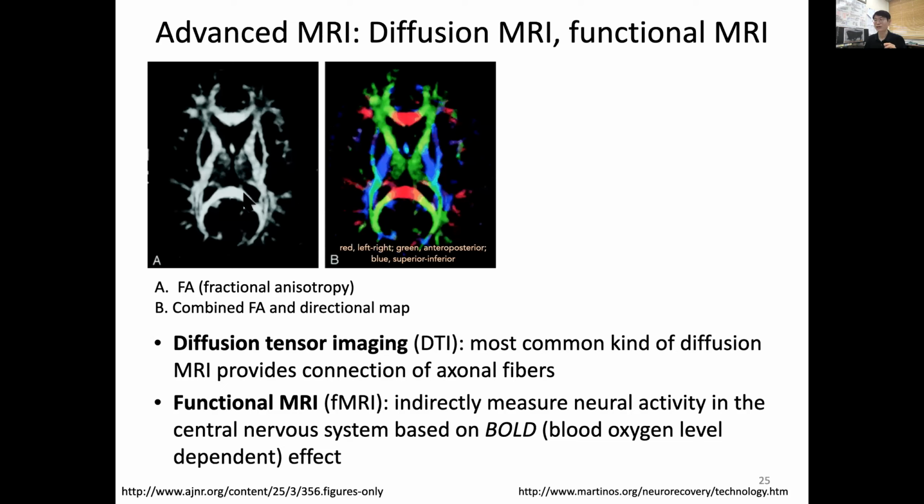especially axonal fibers. So this is actually the brain, and what we are interested in is the mechanism of a proton, which is in a water molecule, right? The movement of water in free space will be uniform. However, think about an axon. The axon fiber tract has a lot of myelination, and that myelination is very, very thin. If you look from the point of view of a proton, or hydrogen atom, or water molecule, you are confined almost in two directions. So your diffusion will be limited to the longitudinal direction rather than across the myelin sheath membrane.